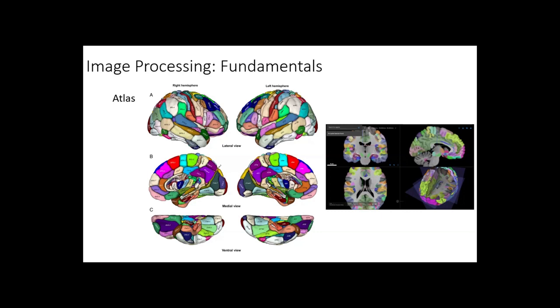Basically, I give you this brain and I want you to do the coloring. Give a color to each region. But this is very time consuming. If we hire a medical doctor, it might take years to get this parcellation, because the image is 3D.